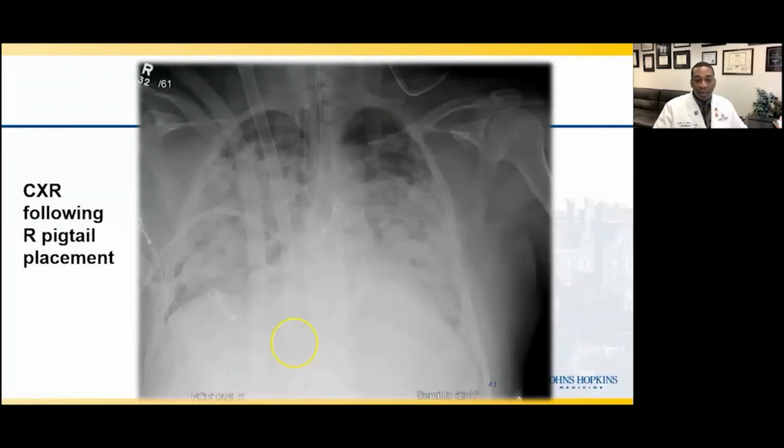And that's why it was great that we had these radiopaque markers. We knew that we needed to retract and reposition the crescent catheter so that recirculation would be minimized, but also to have the atrial infusion zone back in the appropriate position.